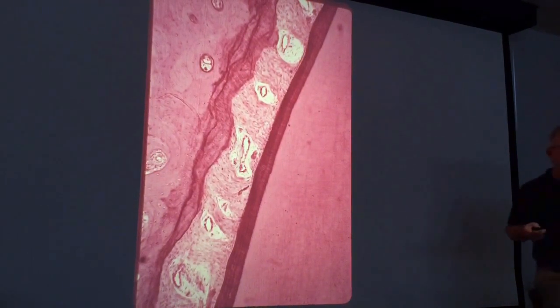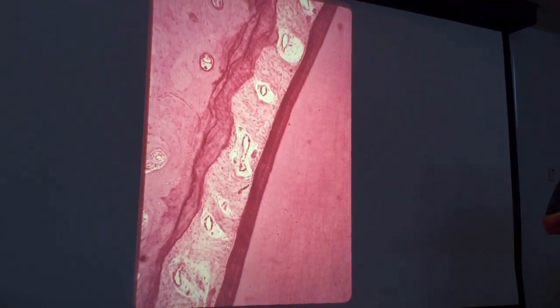Okay, well, we've got cementum, we have bundle bone, we have PDL. What is the tissue that we see surrounding that vessel? Interstitial. Interstitial tissue, which is normally made up of what? Loose connective tissue. And more right there.